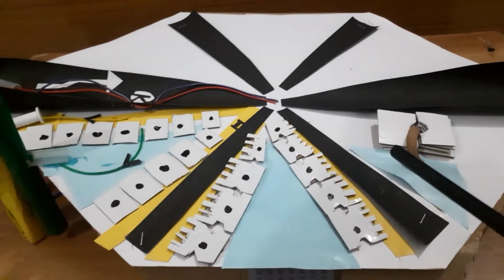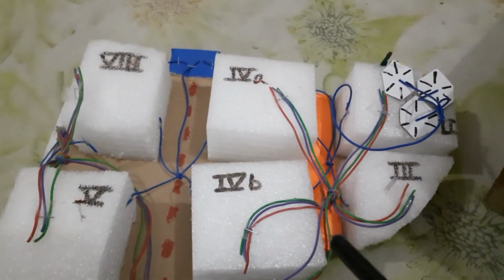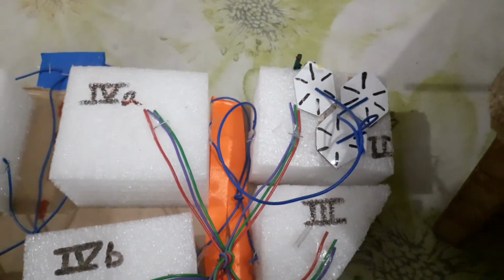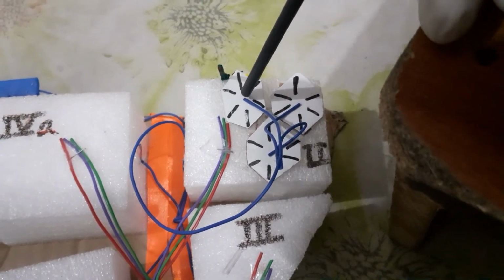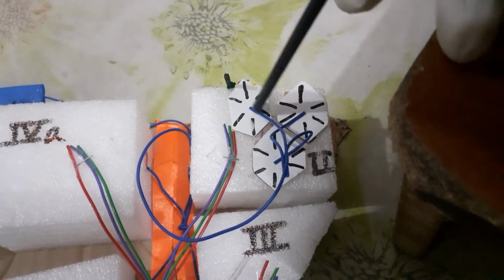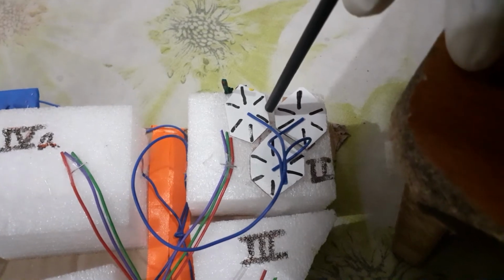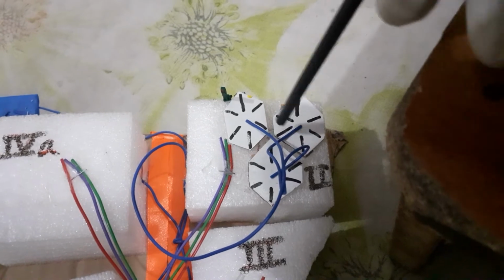This is the difference. And if we talk about the functional status of a liver, then again a diamond-shaped structure is formed in between the hepatic lobules, in which the long axis is the imaginary line connecting the two central veins, and the short axis is in between the two classical lobules.